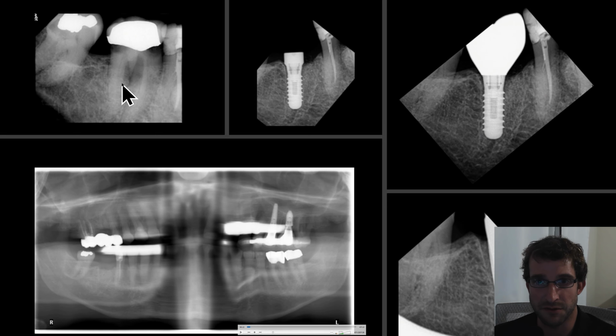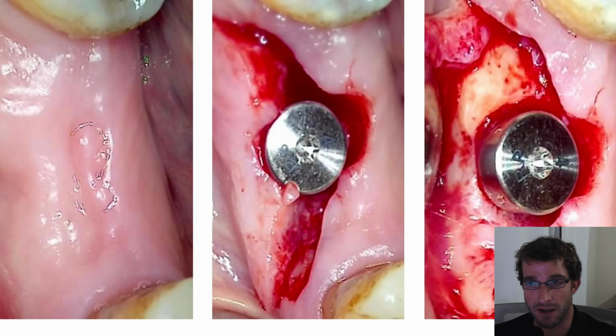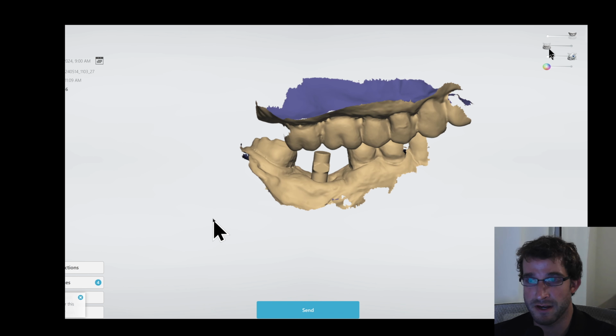The 4-6 had a toothache, unrestorable decay. So we extracted the 4-6, waited 3 months for the site to heal before placing the implant, waited 3 months again for implant integration, and then we installed the implant crown, which we made in-house. Here's some photos of the surgery.